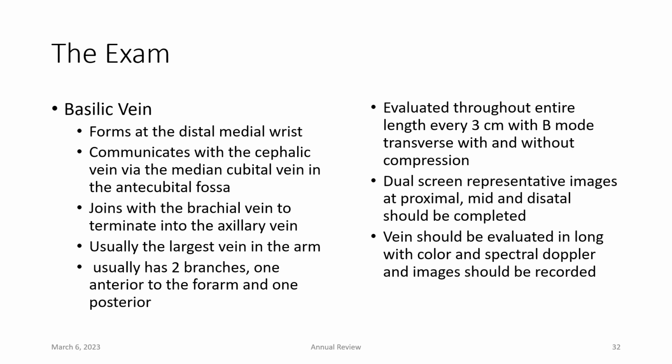We also know that this basilic vein is going to communicate with the cephalic vein via the median cubital vein. So you've already assessed that median cubital vein. Once you add this final component, you should have a really thorough assessment of the whole upper extremity venous system.